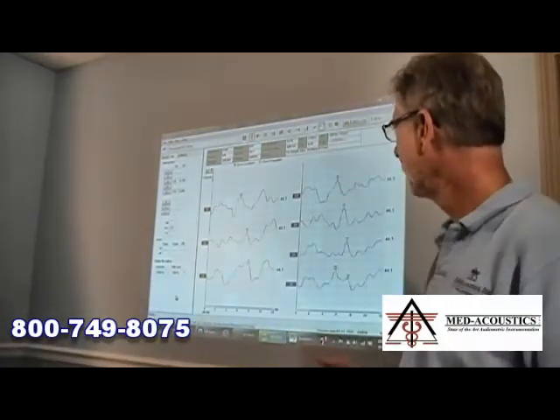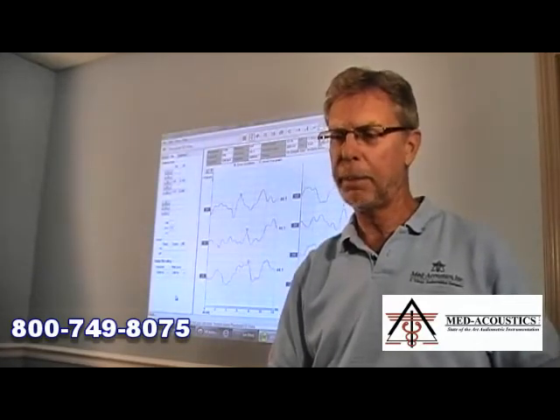So that, I hope, is a good explanation of the benefits of Bayesian weighting, the benefits of the chirp stimulus for both broadband and frequency-specific testing, the benefits of some of the other features in here, like running replications automatically, and even marking waves automatically. Those should be a help. Let me show you some other things.